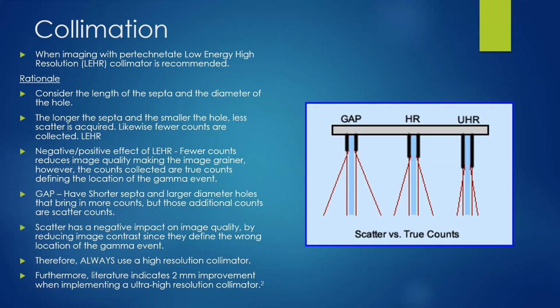Well, most of the procedures I'm going to assume you're going to do are with technetium. And in any type of technetium setup, I really don't know what type of collimation you have, but you definitely want to apply a low energy, high resolution collimator. Actually, we've got three types of collimator designs. We've got one called GAP, general all purpose. We've got high resolution, and we have ultra high resolution.